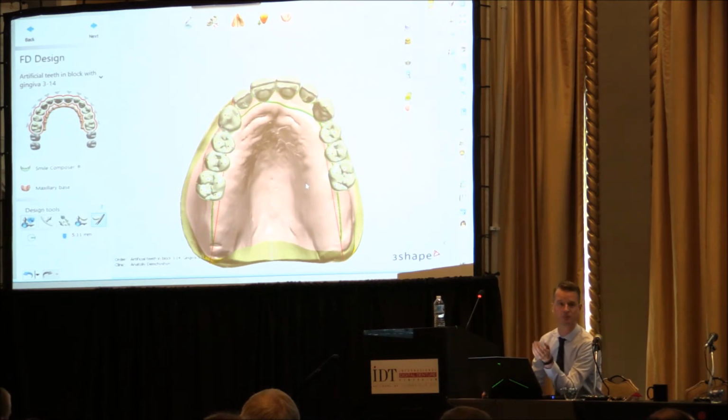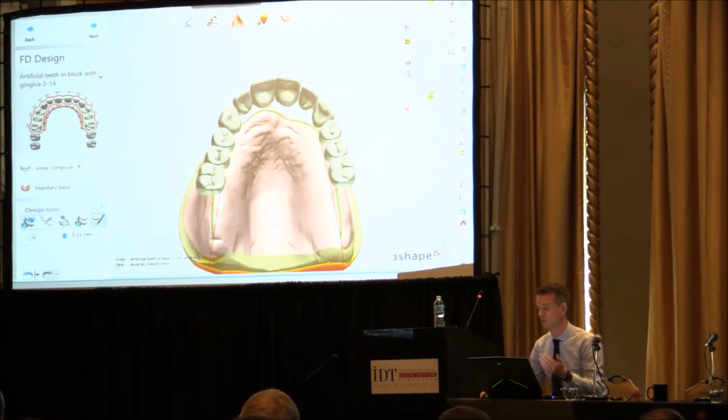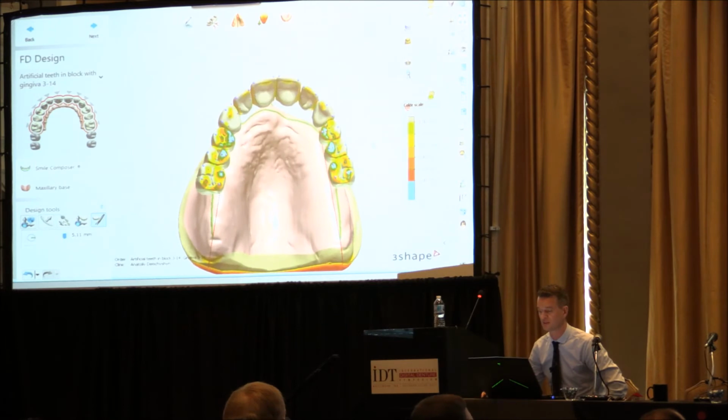You can reduce them in the bottom, but there's no support today from a milling perspective as far as I know. As far as I know, there's no one today that can support really proper, high-quality reduction of teeth in the CAD/CAM world, unless you use pre-manufactured teeth. If you don't use pre-manufactured teeth, it's a different world because then you are completely free. So here we'll end up not using pre-manufactured teeth.